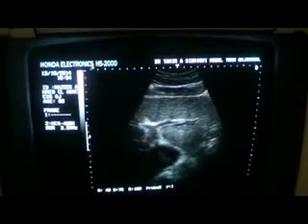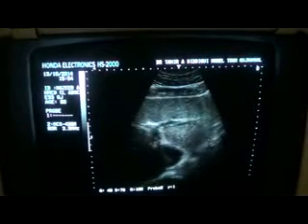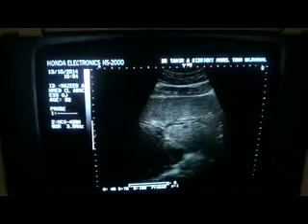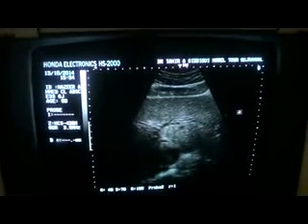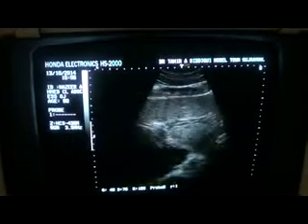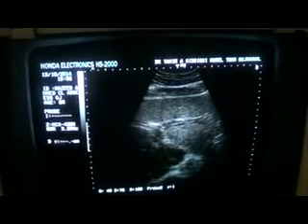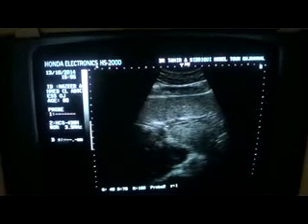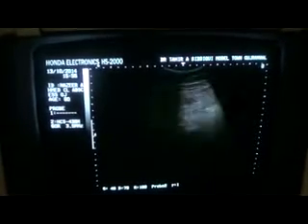Another thing, you will see that there is intrahepatic bile duct ectasia, and the bile ducts are dilated minimally, though not significantly, but you can see that there is dilation of the bile ducts along with this. Now in this scanning plane you can see both. This is the caudate lobe cystic mass, and these are the mildly dilated intrahepatic bile ducts. This is the liver.